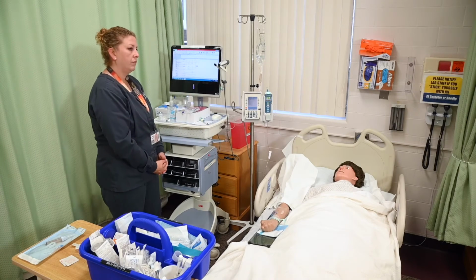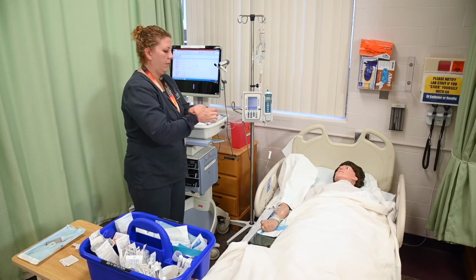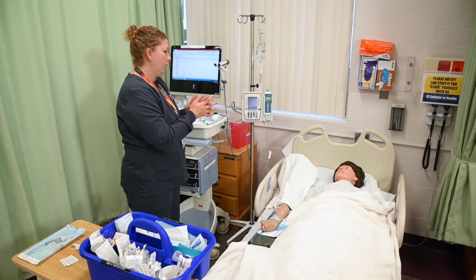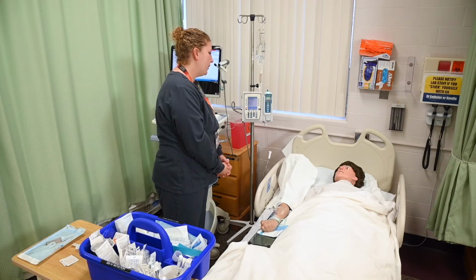This time, perform hand hygiene and provide patient privacy. I'm going to pull your curtain for privacy. Introduce self to patient and family and add your credentials. Hi, I'm Sarah. I'm a student nurse. I'm going to be giving you some IV medication today.